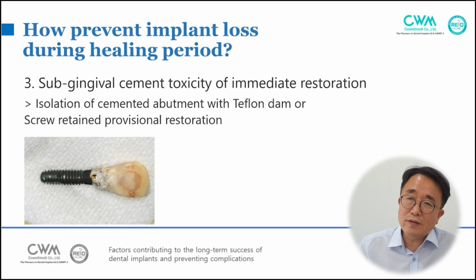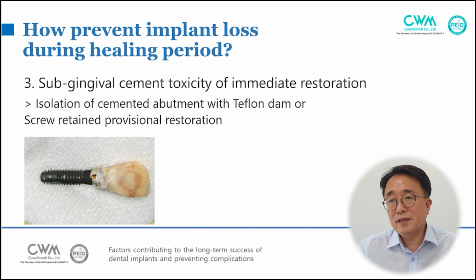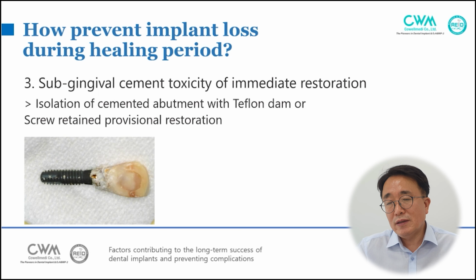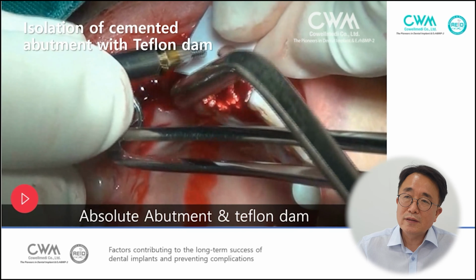This is isolation of the cemented abutment with a Teflon dam, or a screw-retained provisional restoration. So this cement is infiltrated into the socket. This cement toxicity made inflammation in the socket bone, like this.